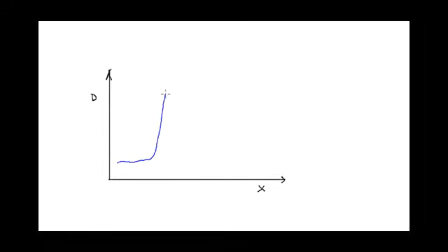So let me show you how this works. I'm going to draw a plot here and explain the analysis. So dose versus distance along the detector plane. And I'm going to draw an example plan profile here of dose. It has some sharp gradients because of the modulation. And here are the measured points from the detector. So how do you analyze this?